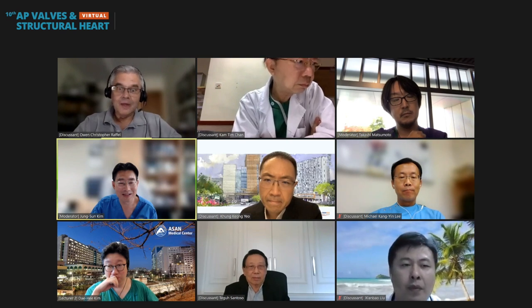Thank you. And these, I think, are the groups of patients where invasive left atrial pressure doesn't really help, except to say they've got severe MR, but you treat the MR and their invasive left atrial pressures don't get better. Yes. So mitral gradient is a little bit tricky. It depends on blood pressure and the residual MR. So in most cases, I check mitral valve orifice area.